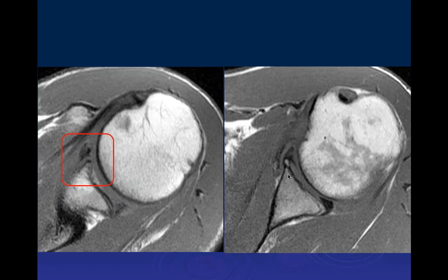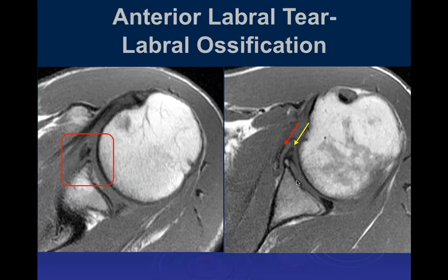And then the structure, we still see it separate from the, I think it's looking more like, again, it could be the anterior band. Actually, okay, I think we're seeing two separate structures now. I think this is the middle glenohumeral ligament you're pointing to there, and then just behind it is probably the anterior band going there. This other structure that we saw as two separate now becomes this structure here. Yeah, anterior band. Well, maybe.